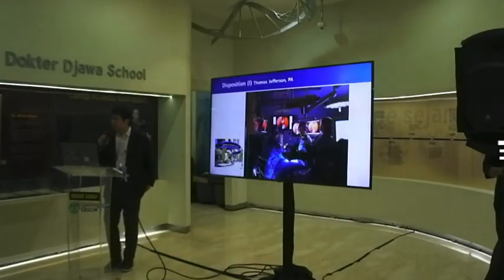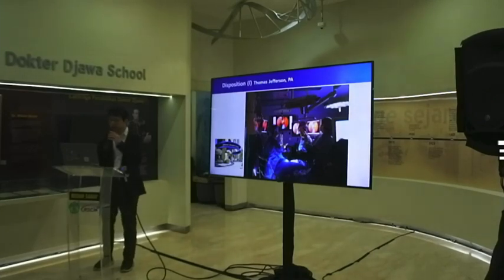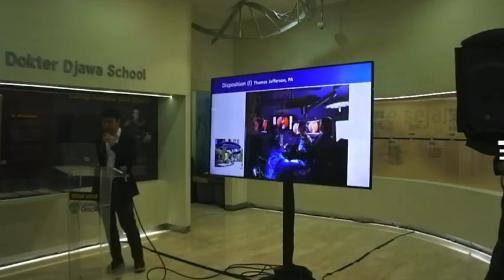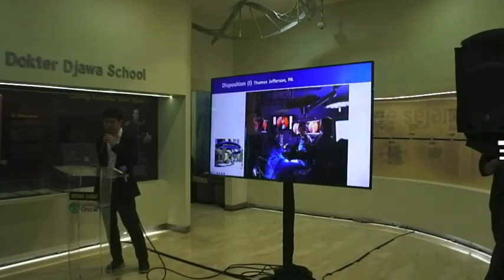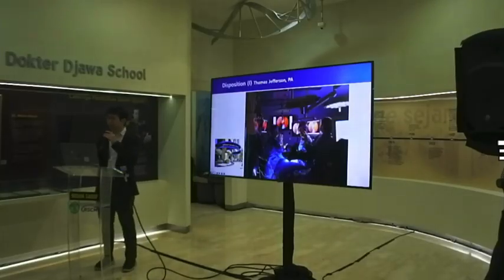There are many famous centers all around the world. This slide shows various operating room setups from different locations, including Thomas Jefferson University in Pittsburgh, USA. This is the operator, the assistant, and the scrub nurse. The operating room setup for endoscopic surgery depends on the preference of the neurosurgeon and the surgical staff in the room.